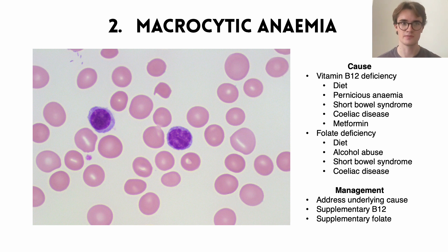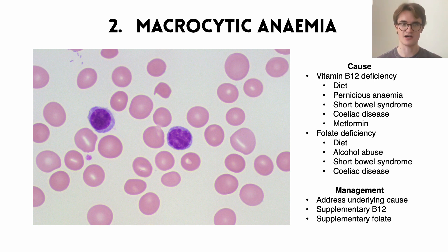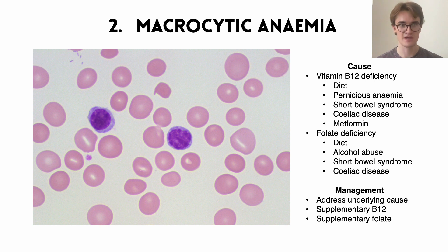The second essential blood smear to identify is macrocytic anemia. Unlike microcytic anemia, here the mean cell volume is larger than normal. Looking at this blood film, we can see that the red blood cells are the same size as or even slightly larger than the two big purple lymphocytes in the center — which is abnormal, as normally red blood cells are significantly smaller than lymphocytes. There are two main causes: vitamin B12 deficiency and folate deficiency.